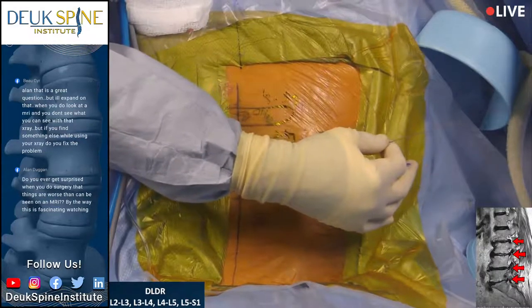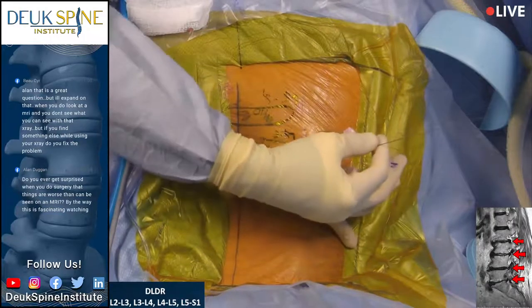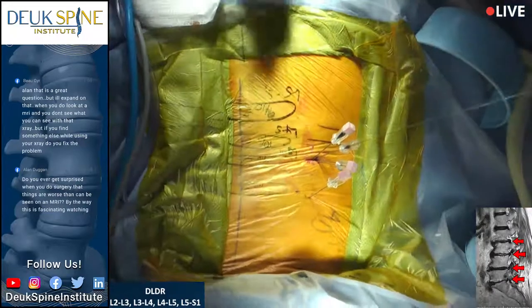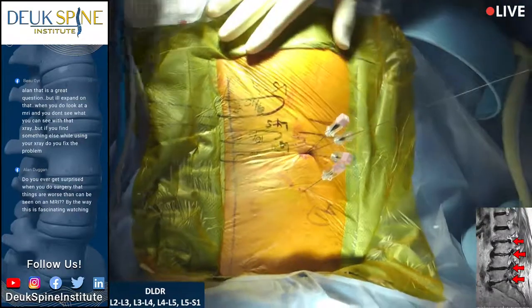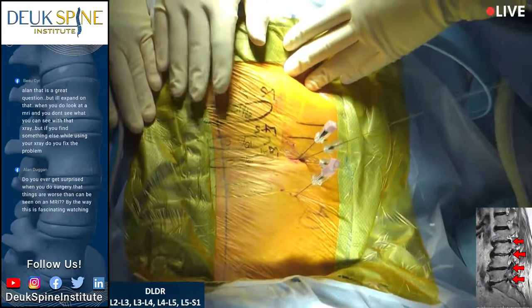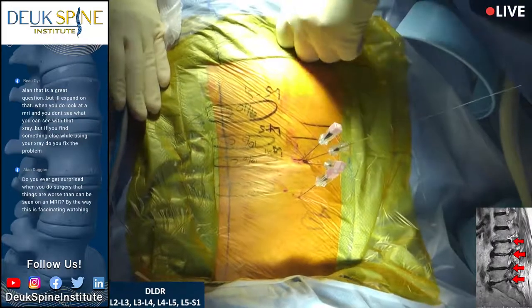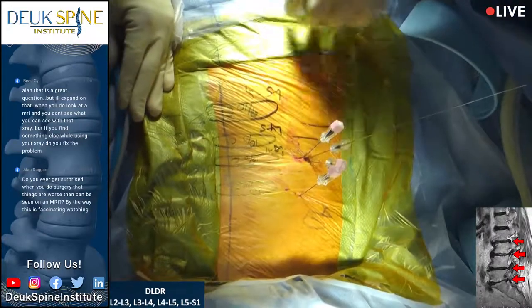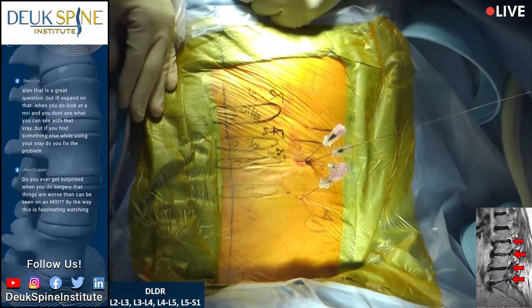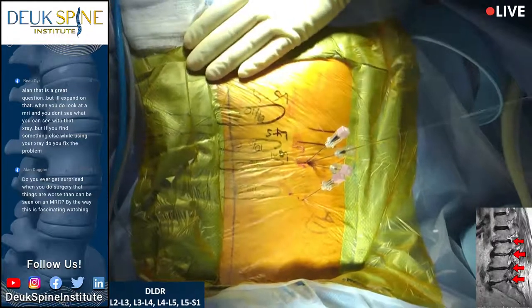Can we start with 4-5? Yeah. Okay, thank you. So this dye is leaking out of the disc, which I injected on my side, and you can put him to sleep. We're going to put you to sleep. Count from 1 to 100 out loud. So the dye actually leaked out through a tear in the back of the disc called an annular tear on the patient's right side and went down his right L4 nerve root.